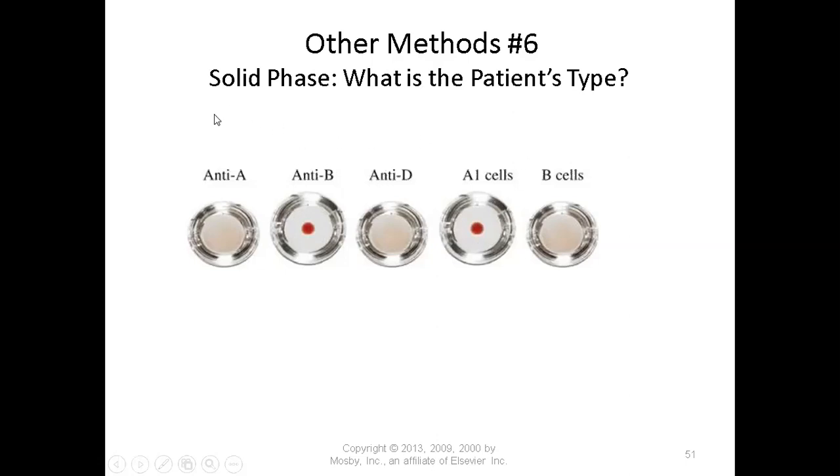So sorry, I really searched far and wide to try to find a different type for this method, but I couldn't find one. So you get the same one, A positive on gel and A positive on solid phase.